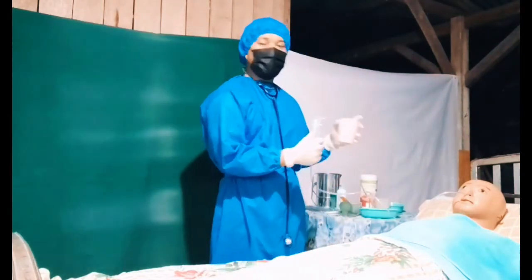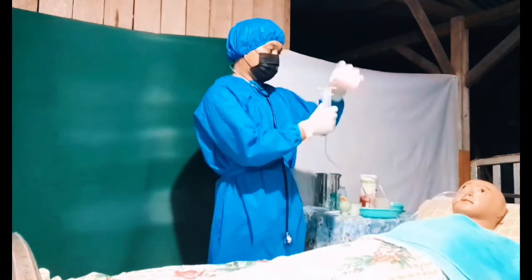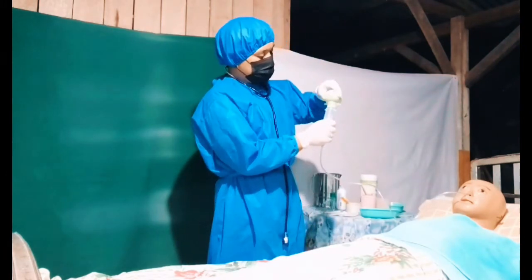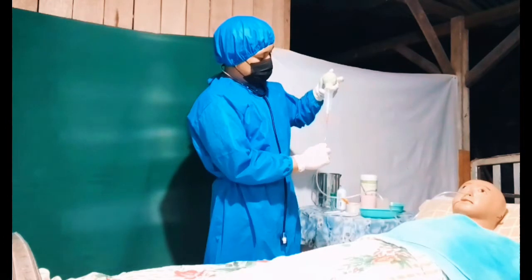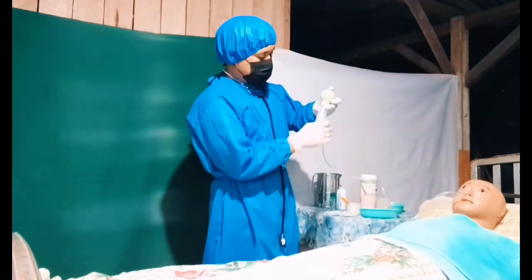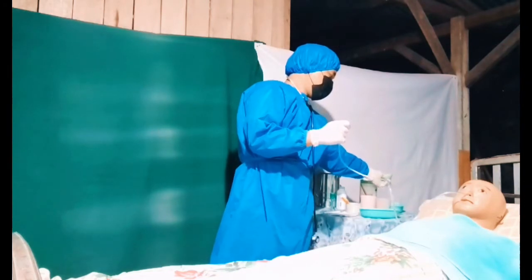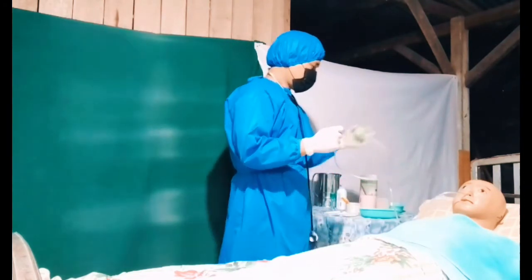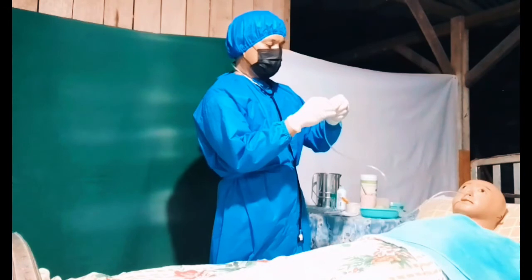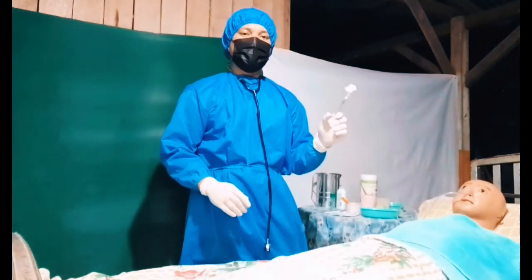Do that again until the gastric content is clear. Again water, 60 ml. Pump it. Then fold or lock the tube. Put the gastric contents right here in the kidney basin. And after that, lock the tube, put it behind the pillow, and wipe some wet cotton on the patient's lips.